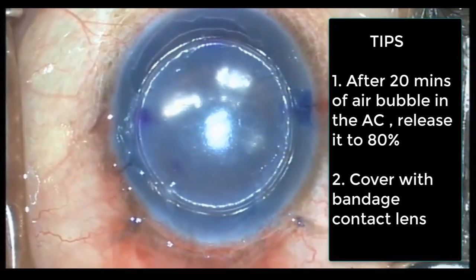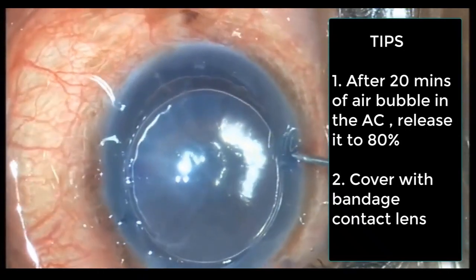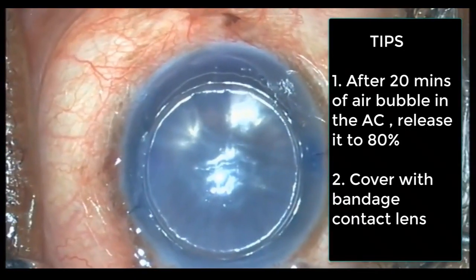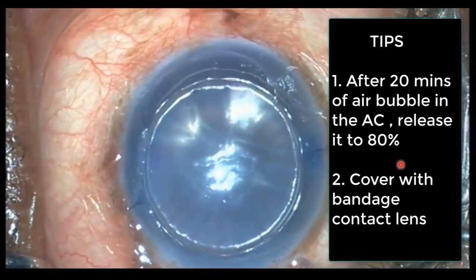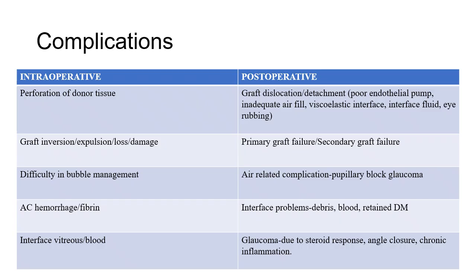And in the end, some burping was done to remove the air bubble from 100% to 80% so that pupillary block does not happen. And cover with a bandage contact lens, because remember, we removed the epithelium in the beginning.